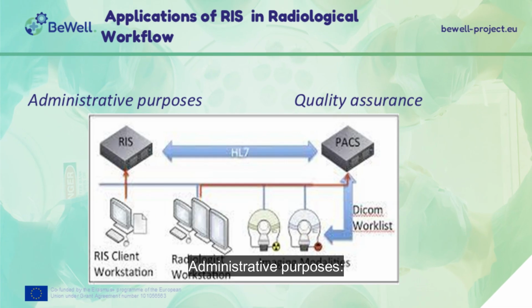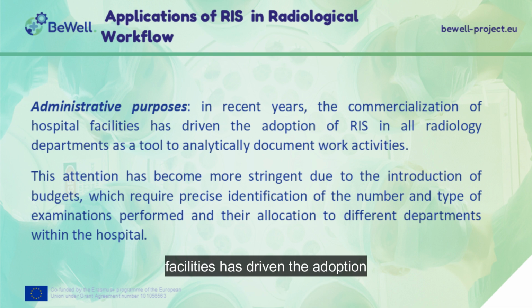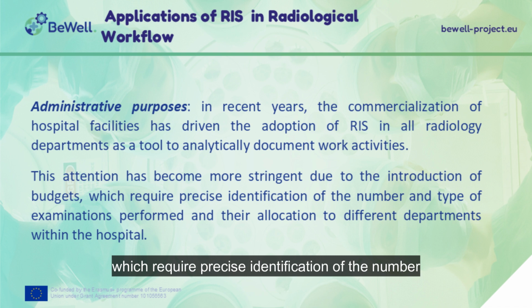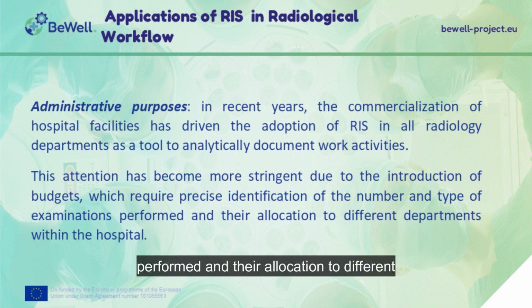Administrative purposes. In recent years, the commercialization of hospital facilities has driven the adoption of RIS in all radiology departments as a tool to analytically document work activities. This attention has become more stringent due to the introduction of budgets, which require precise identification of the number and type of examinations performed and their allocation to different departments within the hospital.